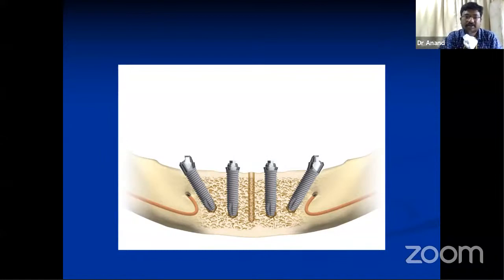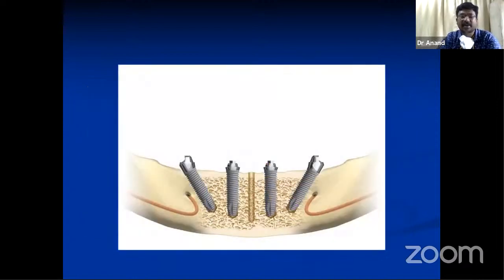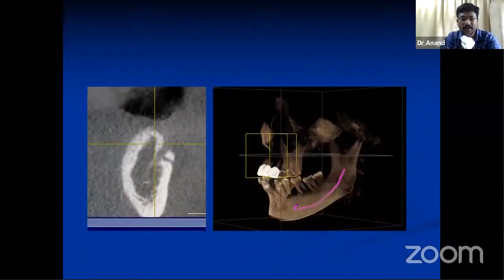Here you can see the inferior alveolar nerve that has been turned like this. That is called the anterior loop of the inferior alveolar nerve. All this while we would have known about the loop that comes anteriorly and goes backward. Does it have any significance? Yes, when you place an implant in such a scenario, you should not damage the loop in implants placed in relation to the anterior region. Nearly 60% of cases would have an anterior loop, and this has to be traced even if somebody is asking you to look out for an all-on-4.